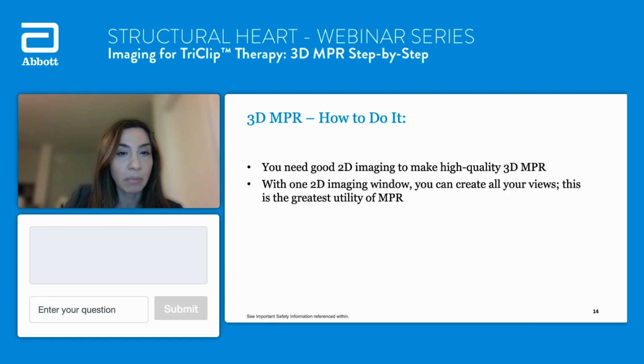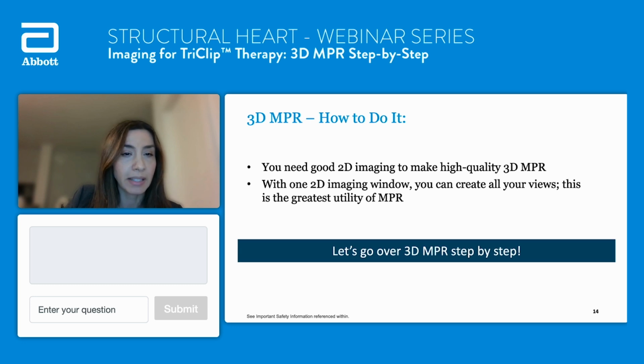And so 3D MPR, in order to build a really good image, you really have to start with a good 2D image. Going back to our first webinar where we described how to get the basic views, you want to build your MPR wherever you have the best 2D image, whether it's mid-esophageal, distal esophageal, or even from your transgastric. You can get a 3D volume set from any of those 3 views and build your MPR. Let's go through it step by step.